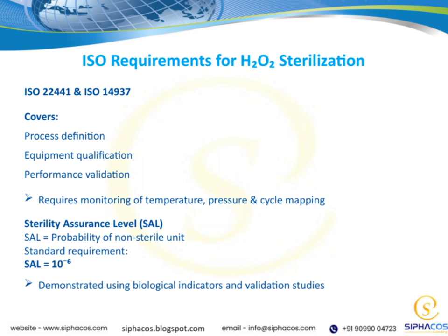These tools provide the evidence needed to confirm that the sterilization process consistently meets the required standards, giving us confidence in the safety and reliability of the sterilized products. All of these elements come together to support our overall goal, ensuring patient safety through effective, validated sterilization processes.